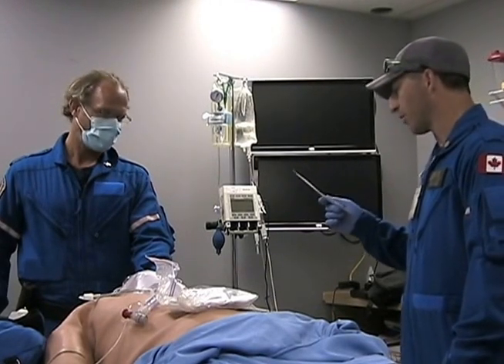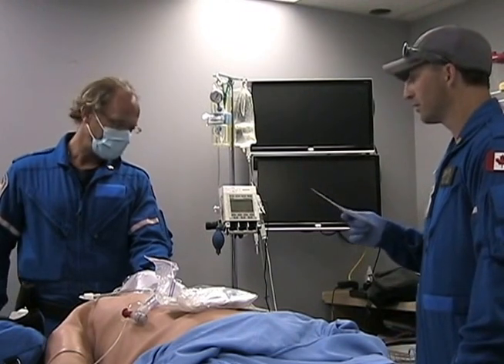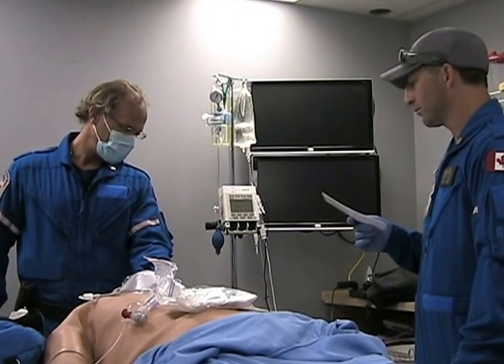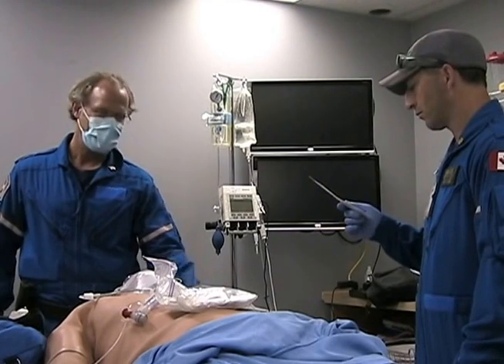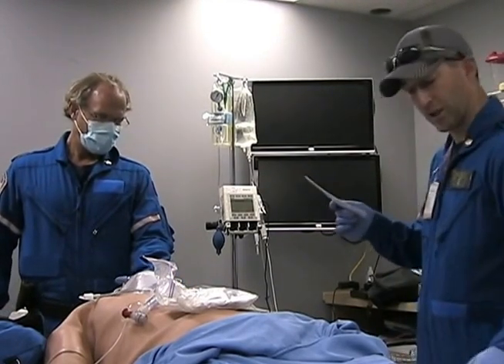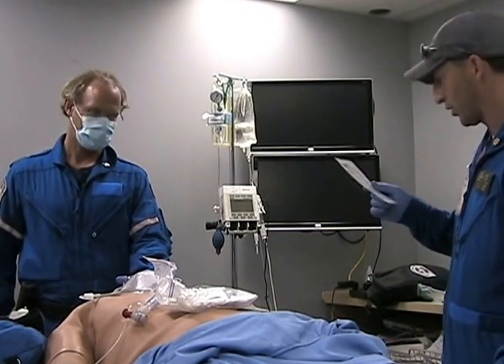Verbalize algorithm and plan, ABC plus minus failed airway plan. Okay, so airway is going to be just a direct laryngoscopy with a Miller blade. I'm going to have a backup of a Mac in case that doesn't work. We also have a backup of our LMA, and we have our crike kit out and open, ready to go. Post-intubation management discussed, sedation. I do have my drugs as appropriate, all of the ones that I need, including rocuronium.